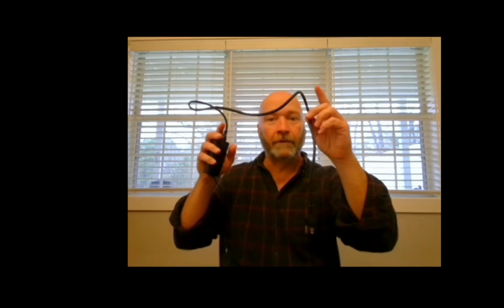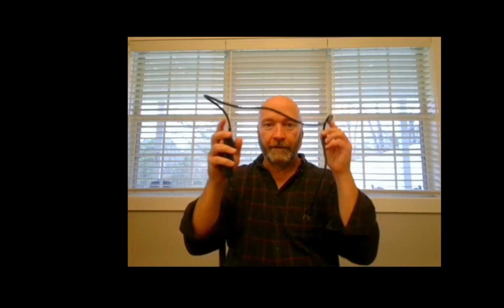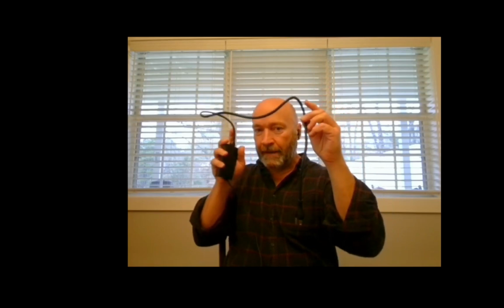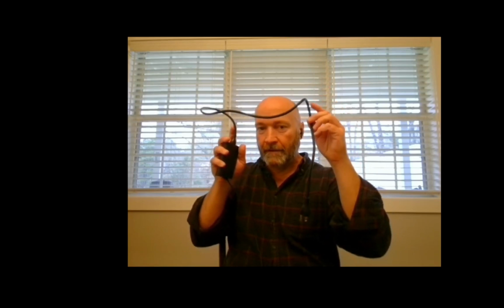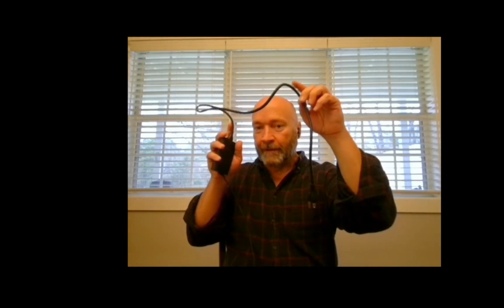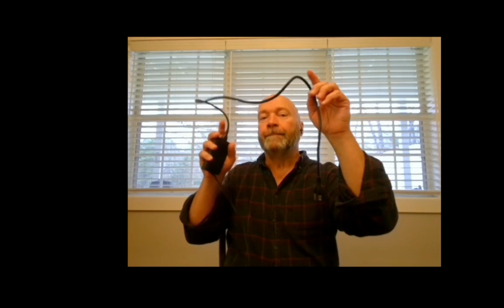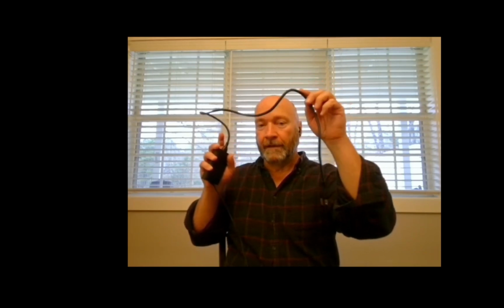So this one's closest to my head. This one I got to reach for to get to it, and I can see through this splenic flexure. So the RPO position opens up the side that's furthest away from the image receptor. Some people will say the upside. So the side that's furthest away from the image receptor, the RPO shows us the splenic flexure.